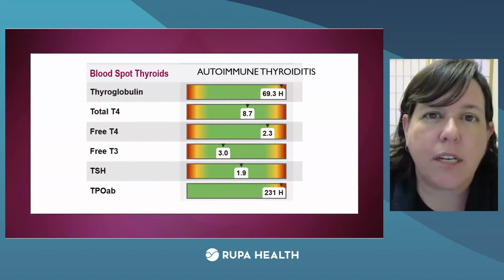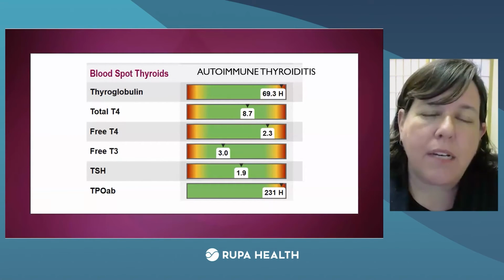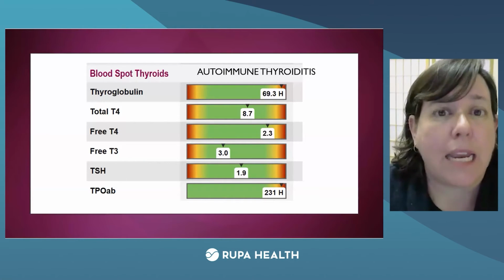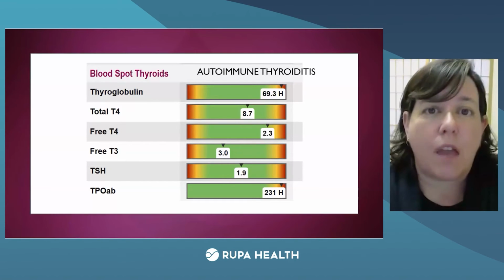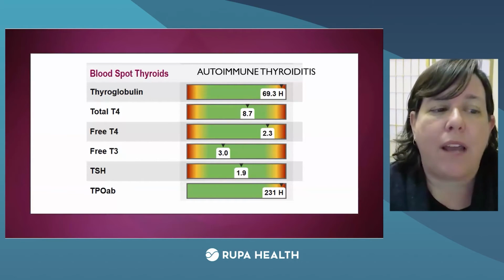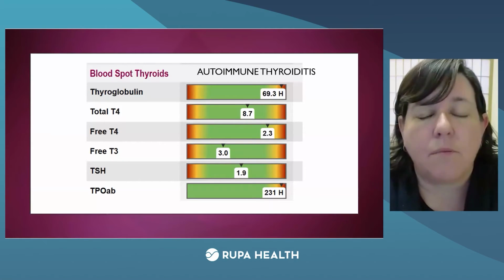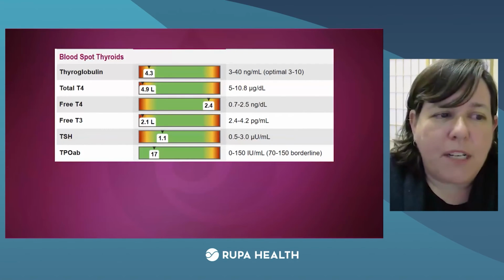I did see in there a question, and I will make sure I answer all questions, just maybe not live here, about a TPO antibody that's high. Thyroglobulin antibodies are much less common. A thyroid peroxidase antibody will show up for over 90% of autoimmune thyroiditis. They can have that plus thyroglobulin as well. It is a rare person who has thyroglobulin antibodies without having thyroid peroxidase antibodies at the same time. I certainly would wonder if this person also had thyroglobulin antibodies. Probably. I think the whole thing is just a mess. That's why I enjoy thyroid so much, because it's messy.